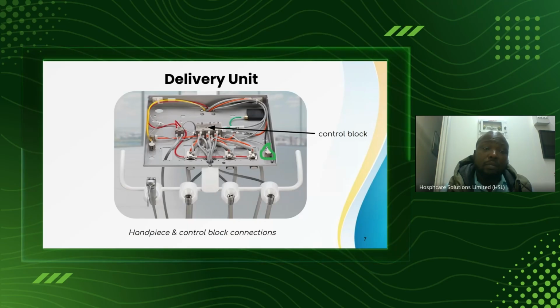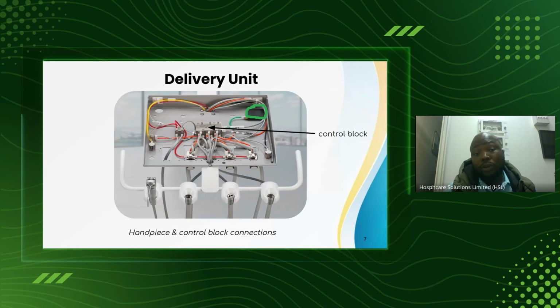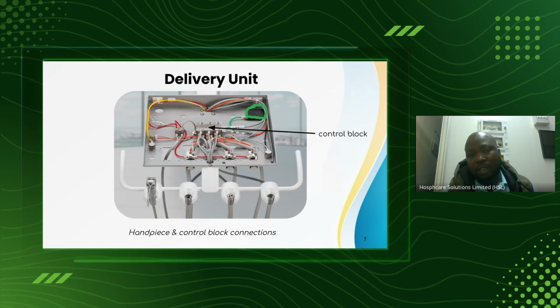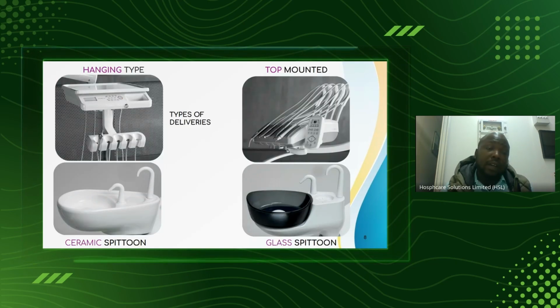So we go on. There's a black thing here. This black thing is very important because it's the pressure gauge. This is where you can monitor the operational pressures. There's a sight glass beside here, so you can see what pressures you are using to drive the turbines. So this is just a normal gauge. So this is now the ordinary delivery.